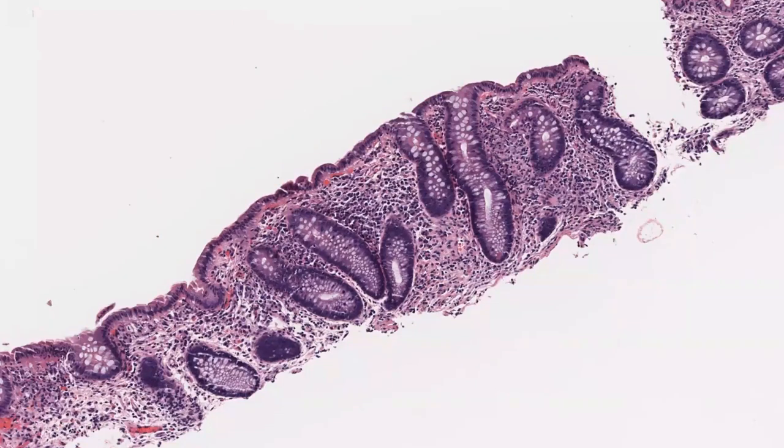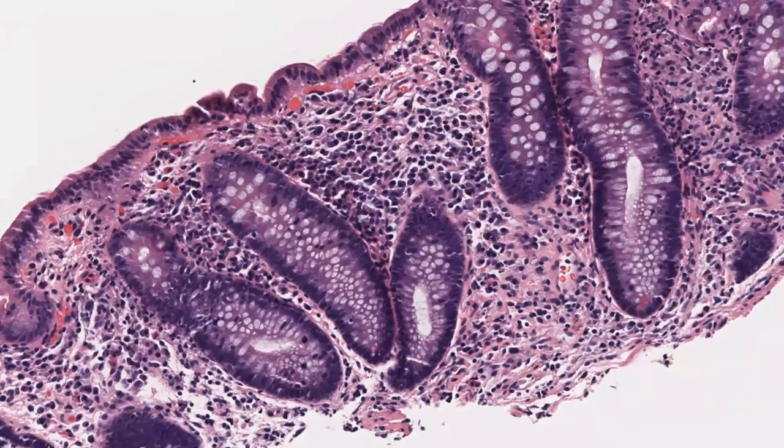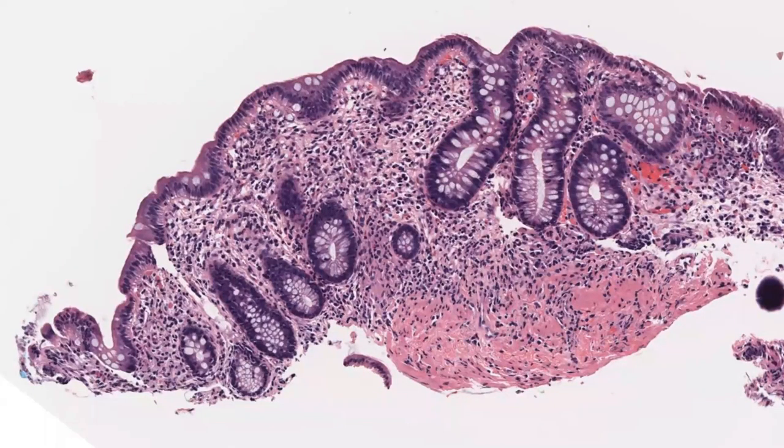We will keep looking. Okay, so there are some areas in the biopsy, like on the right hand side, as you can see, where there is an increase in inflammatory cell infiltrate with loss of the gradient. While on the left hand side of this biopsy there is preservation of that gradient and there isn't a lot of inflammation, for example. So to some extent that tells you that there is a form of inflammation there. In terms of architectural distortion, it's quite difficult to judge based on one fragment, of course, but based on what we saw, we are not sure, but we know that there is a shortening of the crypts. And I told you before that shortening of the crypt is one of these architectural distortion features. So you need to remember all what we've talked about, and you can see that these crypts are quite short.